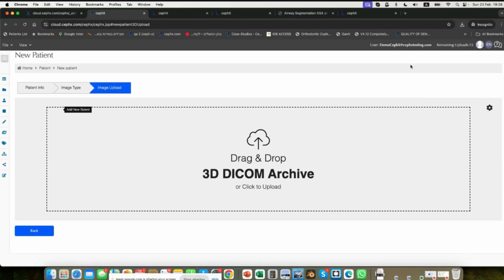I just have a quick question, if that's okay. Sure. If we do adopt this tool during consultations, how quickly can a TC, our treatment coordinator, get on, plug all the information in, and come up with an analysis so they can present it to the patient and sell a case, or convince the patient to get healthier, better treatment, better tooth alignment and bite? Yeah, sure. So the 2D analysis happens pretty much instantly.